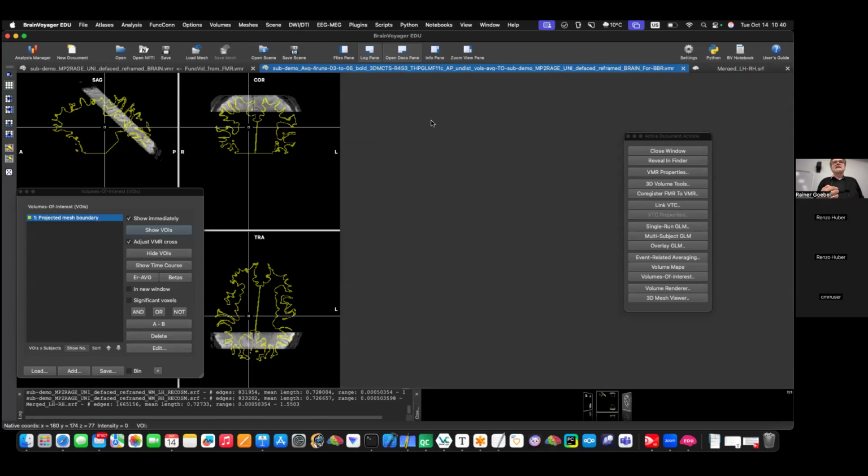You use auto-align, then it's like this. We use auto-align to have exactly this, that over sessions you still have quite the same. Actually, it's a good thing to use auto-align. For neurofeedback, it's amazing because you can have a patient next month, and it's just the same, more or less the same slices, right? It's very nice.